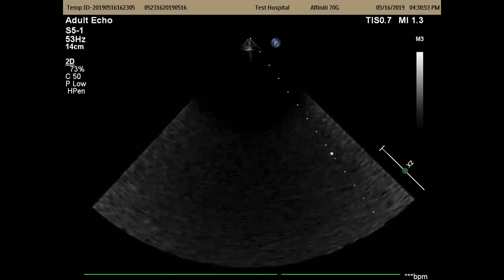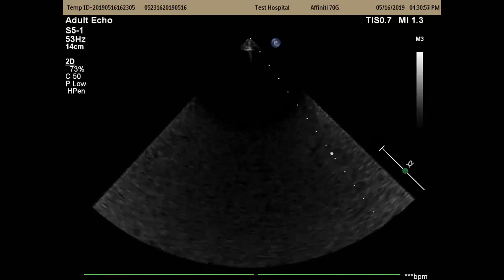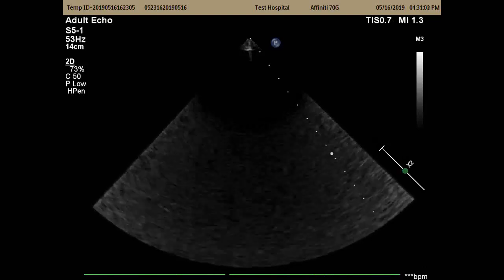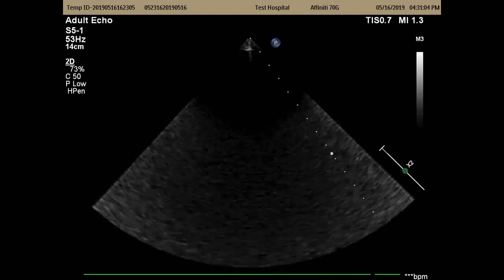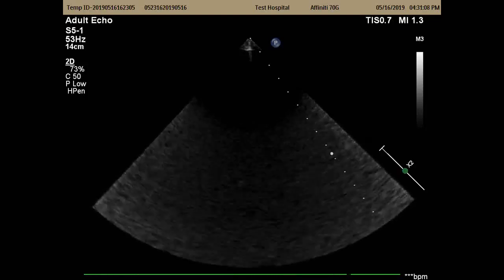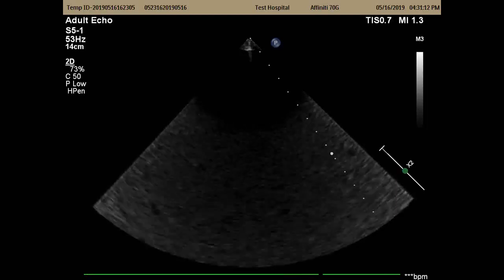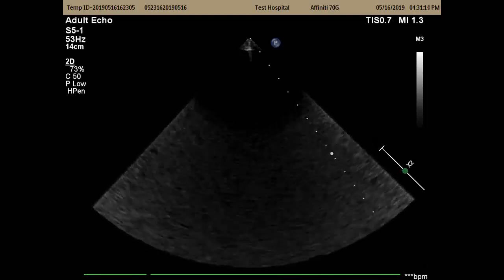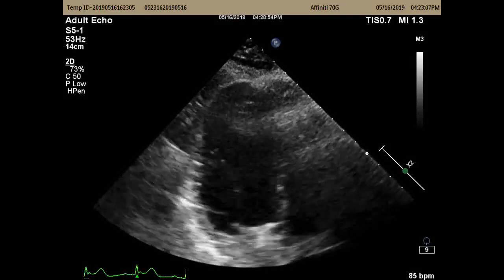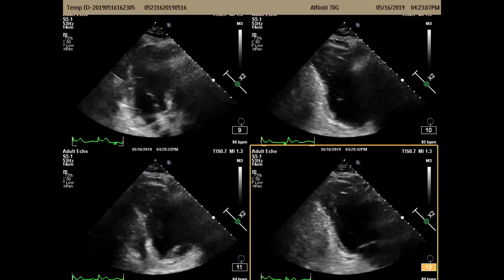Oh, perfect. Thank you. So you want to pick your 3 images. It's obviously helpful if you can remember which ones are your best ones, but we're on the 12. And then I had some good longs somewhere in there. So click on the number, and then double click on it. Double click. Real quick. Yeah, that's good. There you go. Move the 4 up. Okay, cool.